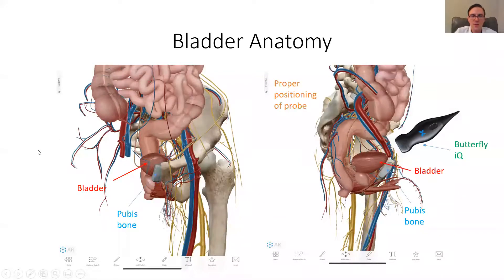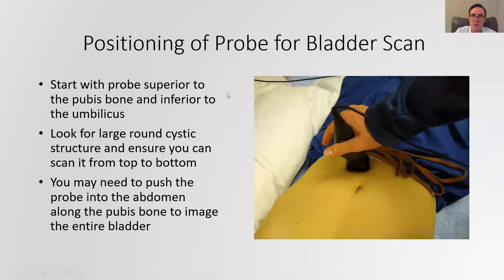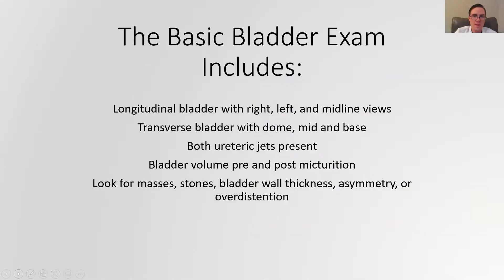The next important thing to talk about is bladder anatomy, which is a critical part of the urinary tract exam. You don't usually have to worry about bowel gas in the way because the bladder is close to the surface, but you do have to worry about getting around the pubic bone, which can get in the way. You want to find that anatomical landmark and have the probe right on top of it — sometimes you actually have to push in a little bit to get around the pubic bone so you can image the entire bladder. Proper probe positioning is between the umbilicus and the pubis, and you're looking for a large, dark cavity, which tells you that you've found the bladder.